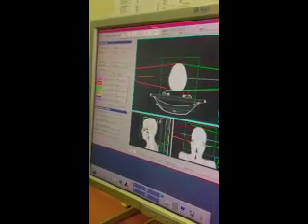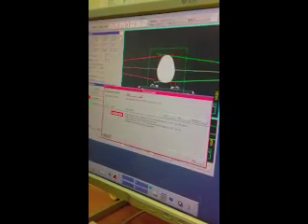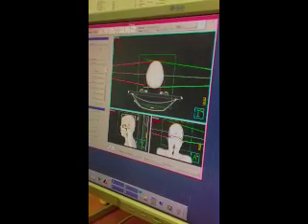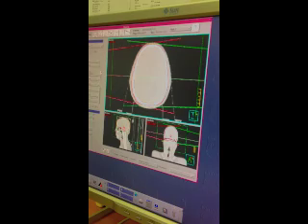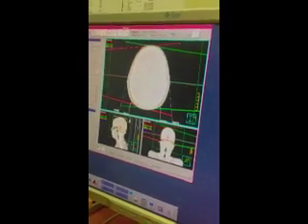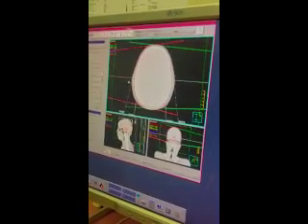For the case of whole brain irradiation, we're going to do a prescription of 30 gray, so 3000 centigray in 10 fractions. Once that's computed, you can turn your isodose distribution on. Red will be your 30 gray, your dose you're prescribing to the patient. 98%, which is green. 95%, which is yellow. And if you wanted to see some lower lines, you could do 90% in purple, 70% in blue, and 50% in orange.